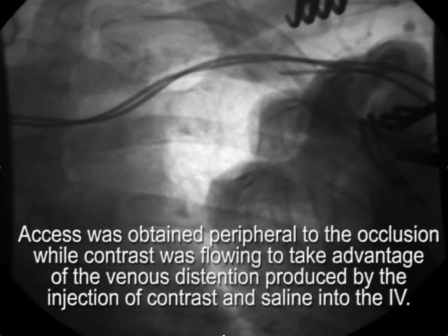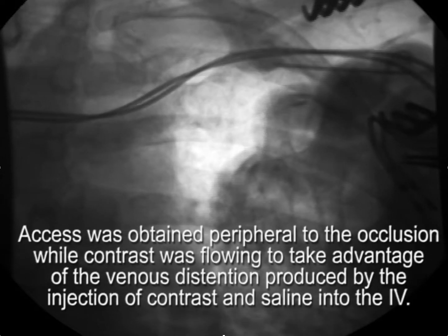So in the case that we just illustrated, access is obtained peripheral to the site of occlusion. It's important to obtain access peripheral to the site of occlusion, and this is more easily done if the vein is entered while contrast is flowing, to take advantage of the venous distension provided by injection of contrast and saline into the IV.